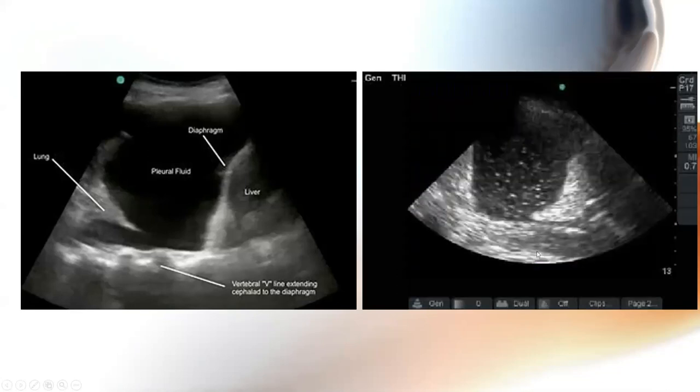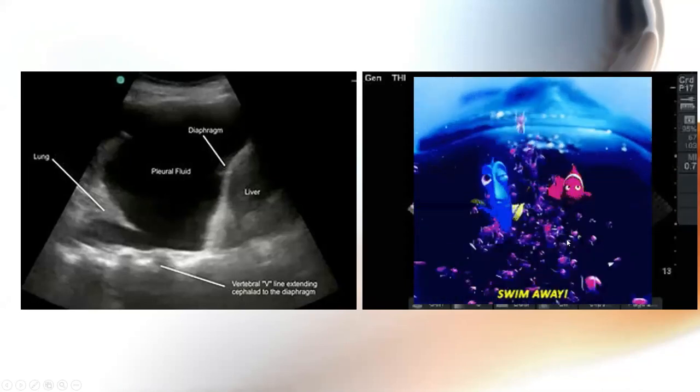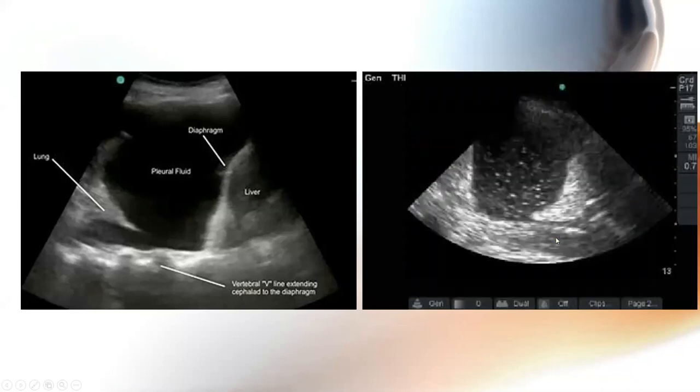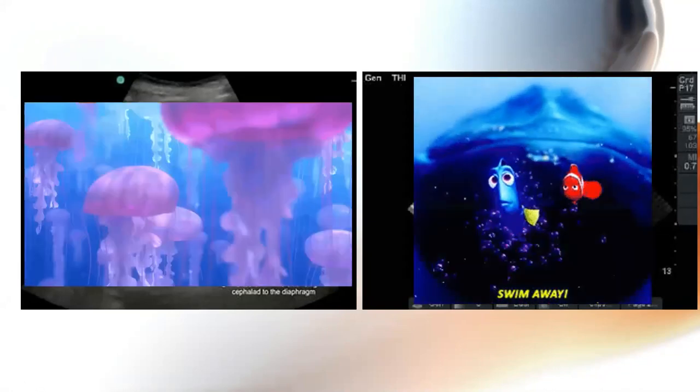So if you haven't gotten the sea creature theme, this is called the plankton sign. I did not make that up. We call this plankton. So I showed you a picture of krill because I don't have a picture of plankton. Anyways, this will show you that this is also complicated. Complicated could be blood, it's probably infectious, but there's schmutz inside and it probably needs a chest tube. Swim away.